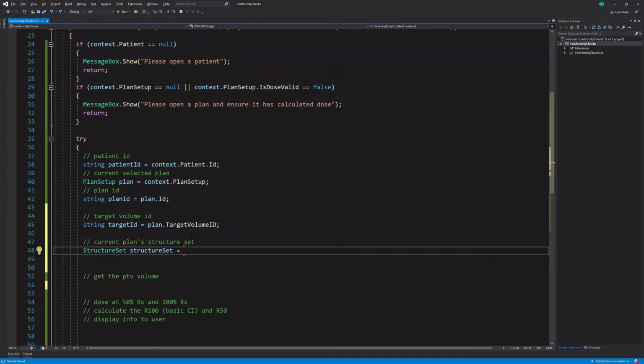Okay, so structure set. I'll just explain why really quickly. If I say var, and I did context dot plan setup dot course on accident, then there's nothing wrong with this. Var does not care what we give it, because what it's doing is figuring out what its value type is going to be on the fly. Basically it's waiting until it's defined, and then it's saying, oh, I'm a course. So from now on, I'm a course.